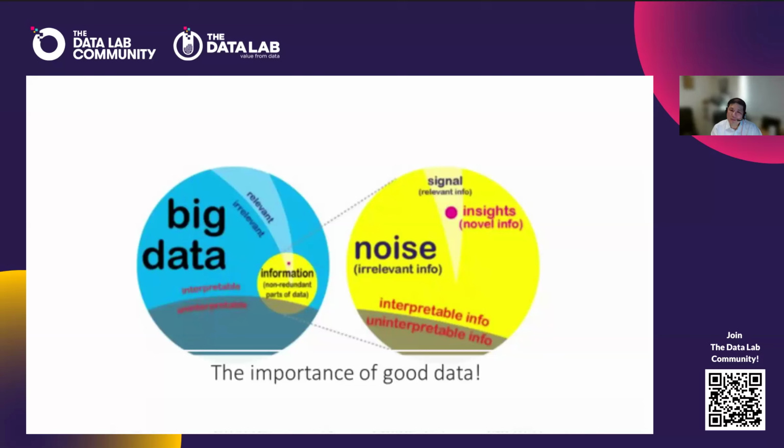And the importance of big data is really important because data needs to be good. That's why mammography and breast cancer has been at the lead of this discussion, because with mammograms, you see something, you say, I think that's a cancer or not, and actually you do have the result because the women come back and we do a biopsy. So that's why we've been leading the field in radiology, with 80% of AI algorithms in the FDA being radiology based, and because of the good quality of the data we have. And that's going to spread. And the lessons that we learn in radiology, or the problems that we have encountered, hopefully we will hurdle over and then teach the other ologies as they come into the world of AI as well.